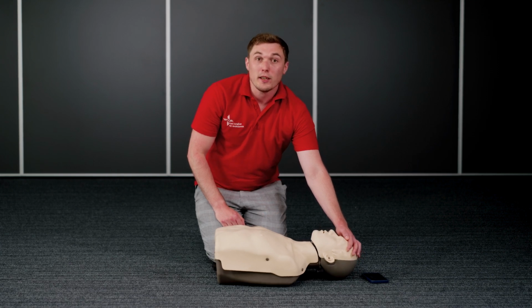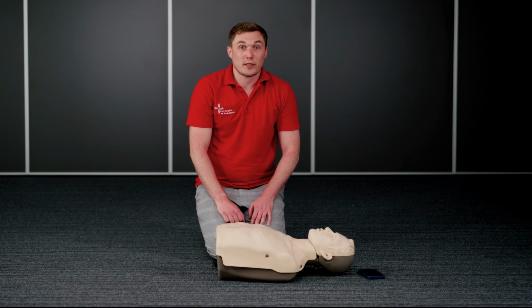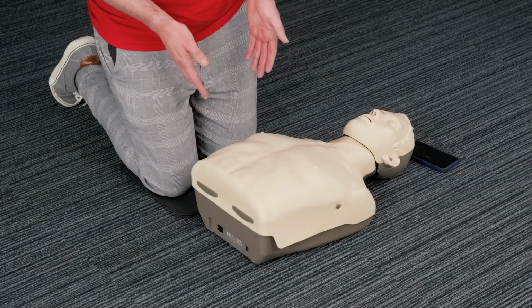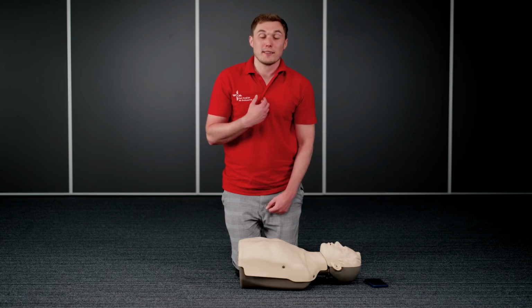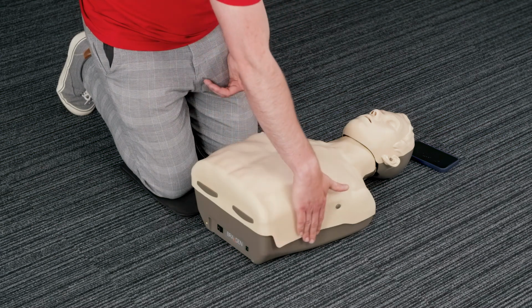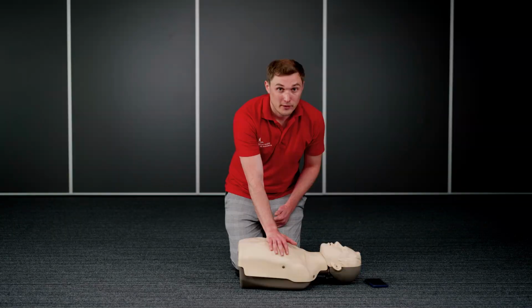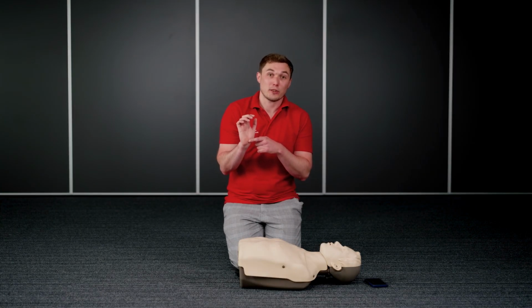If at that point they're not breathing or they're not breathing normally, I'm going to start chest compressions. It's really important that you kneel down next to the side of the casualty as close as possible. I need to find where my hands need to go on the centre of the chest. The way I'm going to find that on the casualty is taking the palm of my hand, bringing that up the side of the torso up to the armpit and then across to the centre of the chest. What I want is the heel of my hand at that point to be in the centre of the chest.